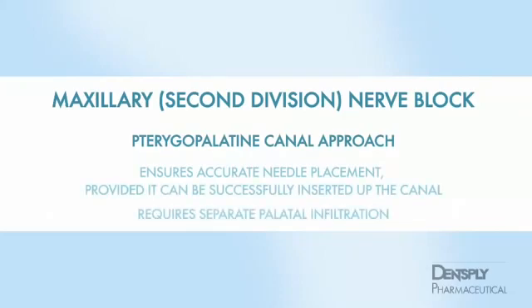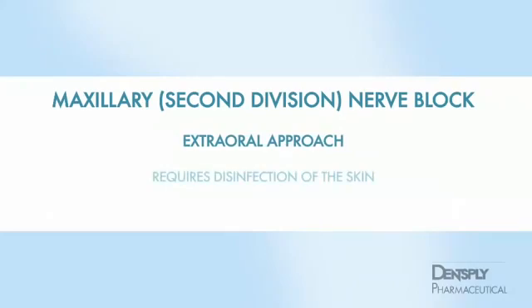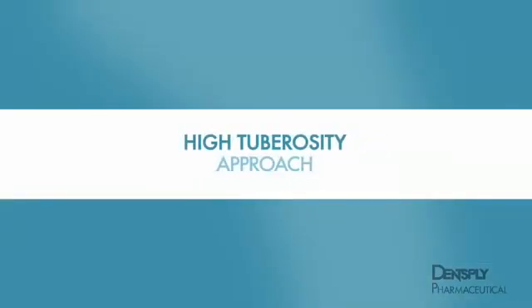This injection also requires a separate palatal infiltration to minimize discomfort. The extraoral approach, in which the pterygopalatine fossa is accessed percutaneously, requires disinfection of the skin, is rarely used, and will not be demonstrated.